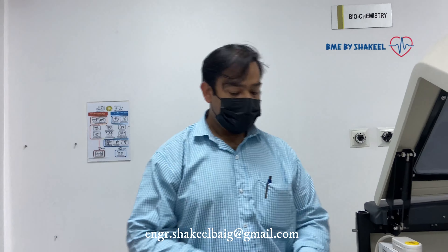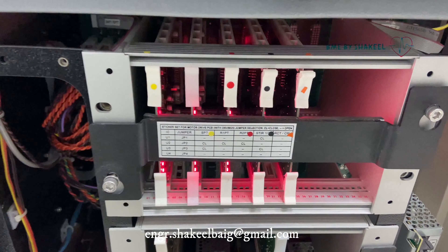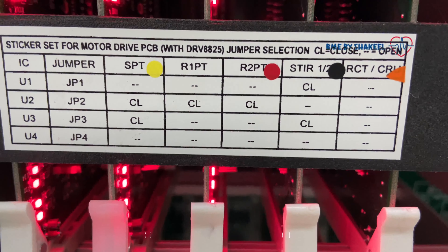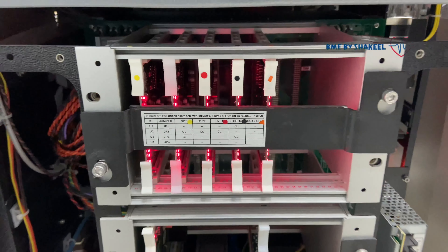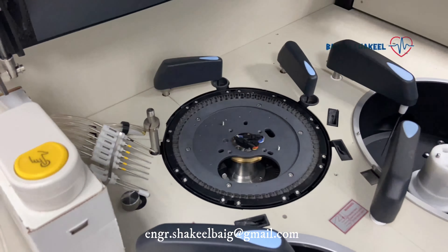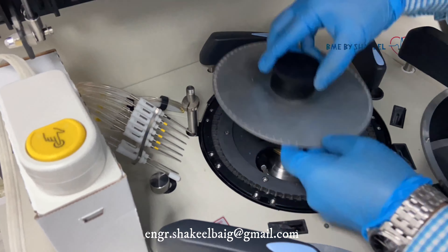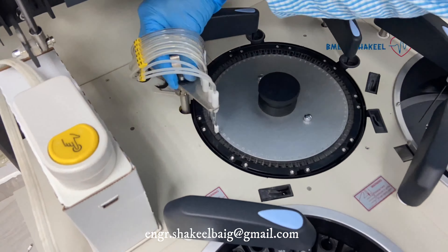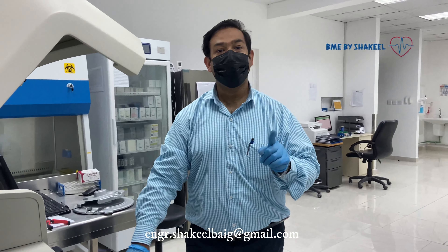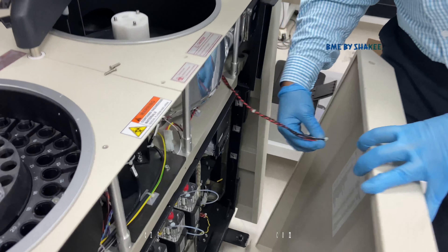Because we already found the problem, we are now going to pack the machine back up. If you want to connect the front cover, don't forget to connect the power cable — you can see this power cable should be connected here.